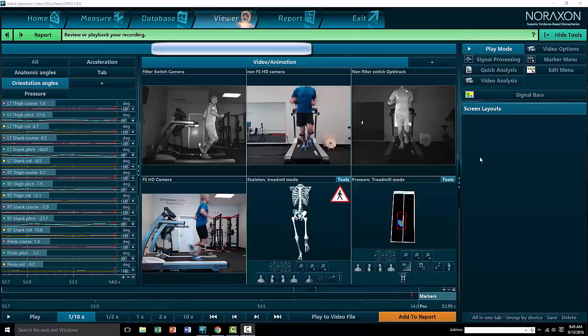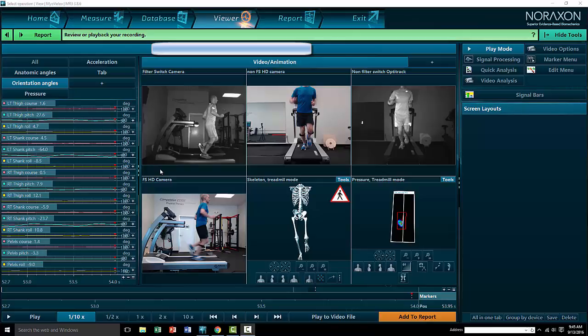What you see on the screen here is exactly the software and the data we capture during our assessment. On the left-hand side of the screen, you'll see angle measurements for every angle from the thoracic spine down to the feet. These 3D angles are able to catch everything in a forward direction, lateral direction, and even rotational direction. We're one of the few running centers in the country that is able to capture 3D data, in particular rotation at the hip and the knee, which is very important for runners who have patellofemoral syndrome or hip impingement.